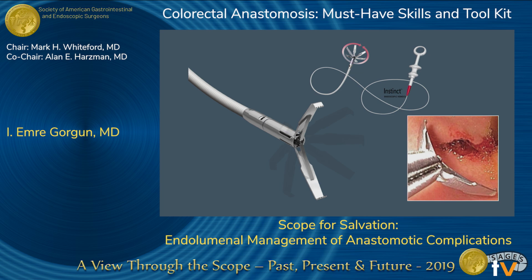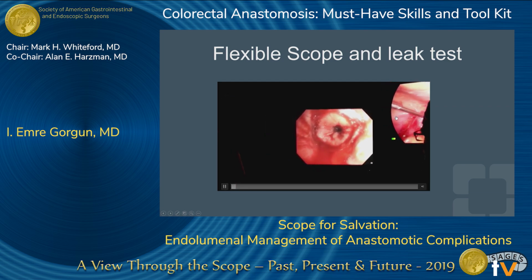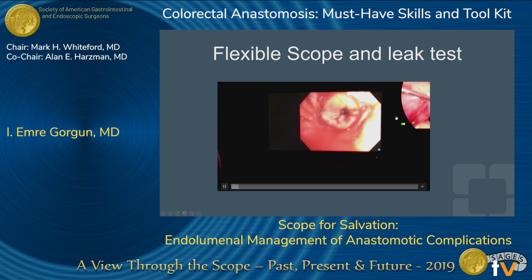The key here is to be able to really rotate them, to get into the right location and successfully manage what you need to manage. You need to be able to successfully rotate them. And the key, if the rotation is not from the handle but more so from the sheath where the endoscopist can control it, then you will have much more control. This is a flexible endoscopy. We heard this from the other speakers as well.